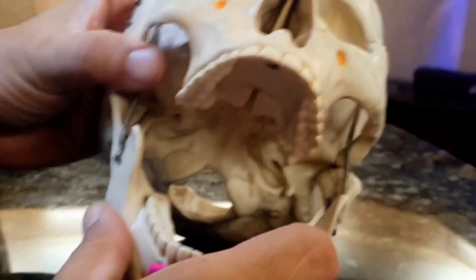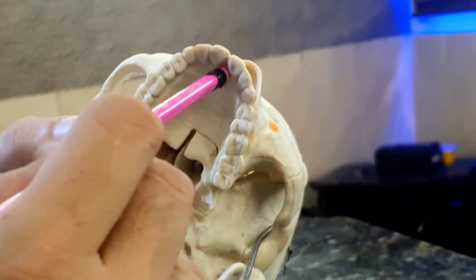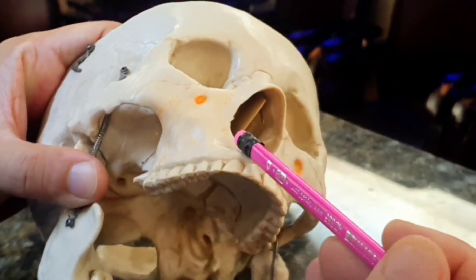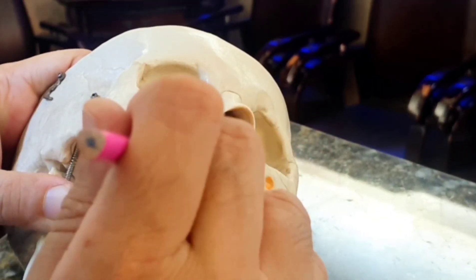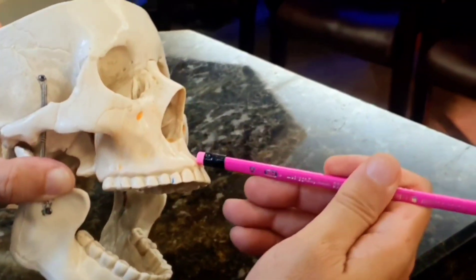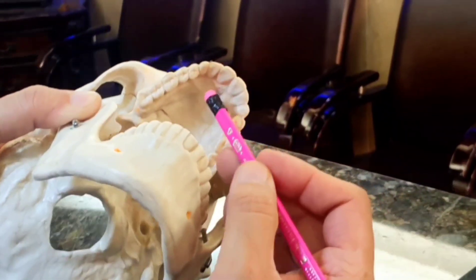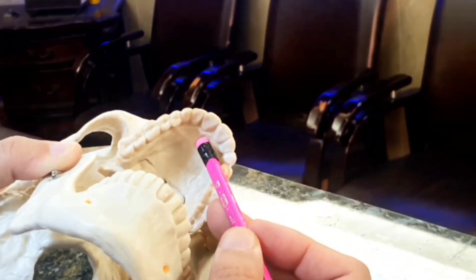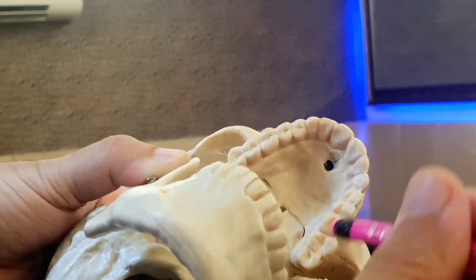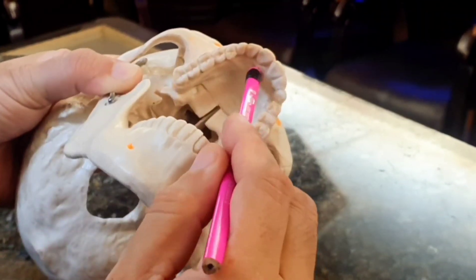When it comes to the maxilla, you would have the nasopalatine block. To get the nasopalatine region, if you're working on the anterior teeth, first give infiltration anteriorly at the apex of the teeth. Then when the papilla is numb, put your needle into the papilla at about a 45-degree angle and insert it inside. Inject a little local anesthetic until it starts coming out from the palatal side — that numbs the area and makes the next injection painless. Then directly approach the nasopalatine canal and numb the nasopalatine nerve by injecting straight into it.